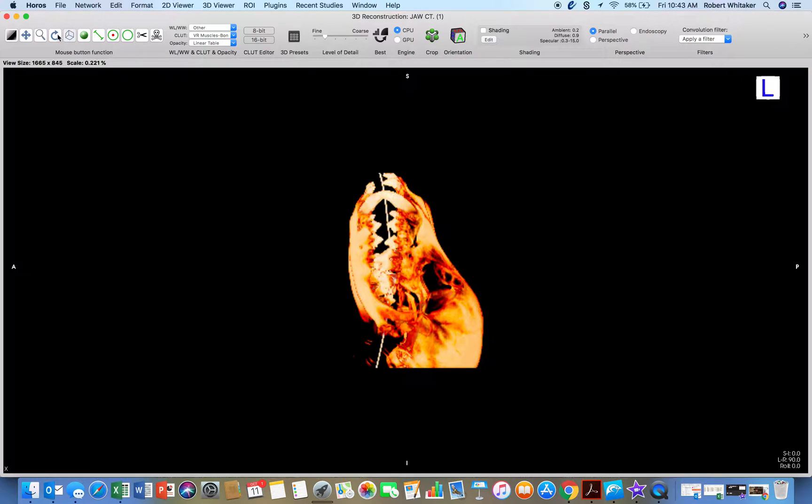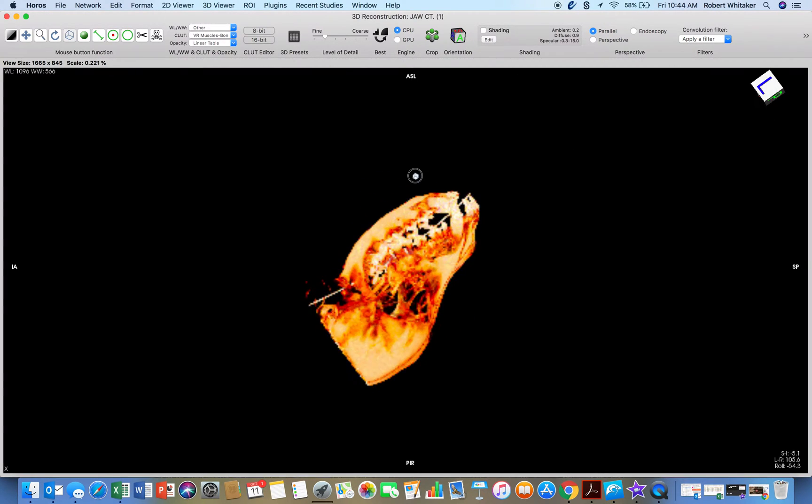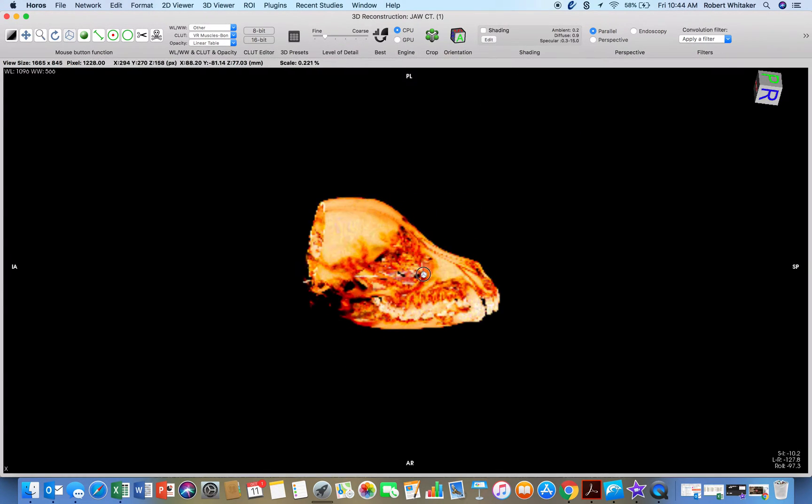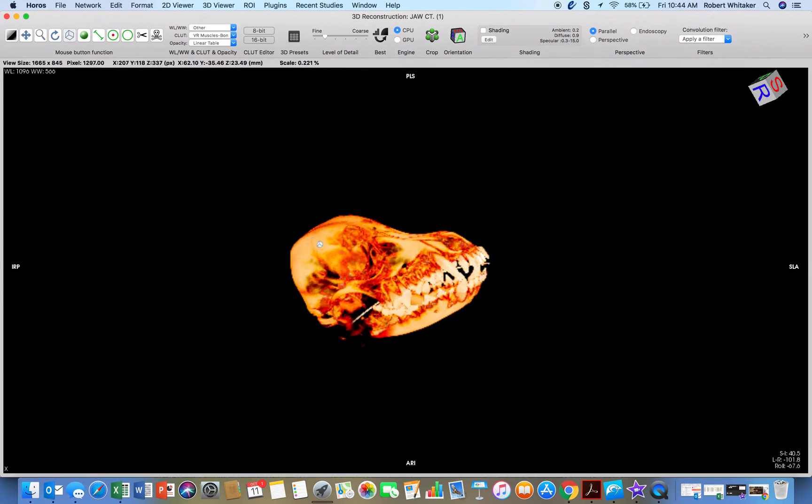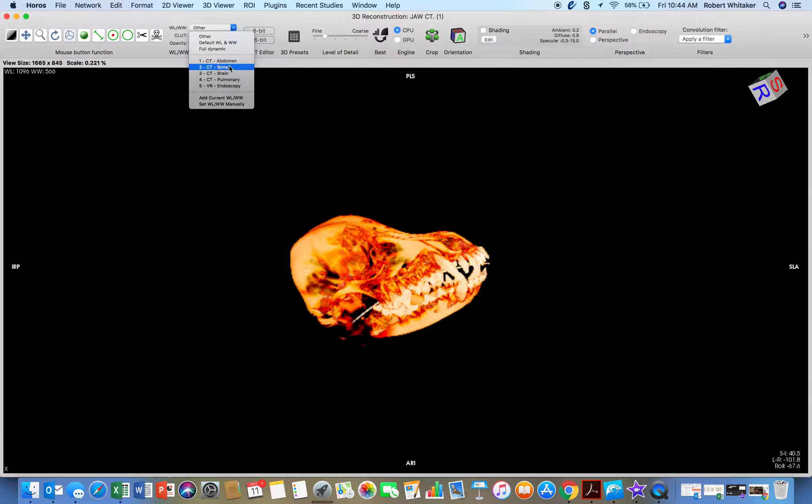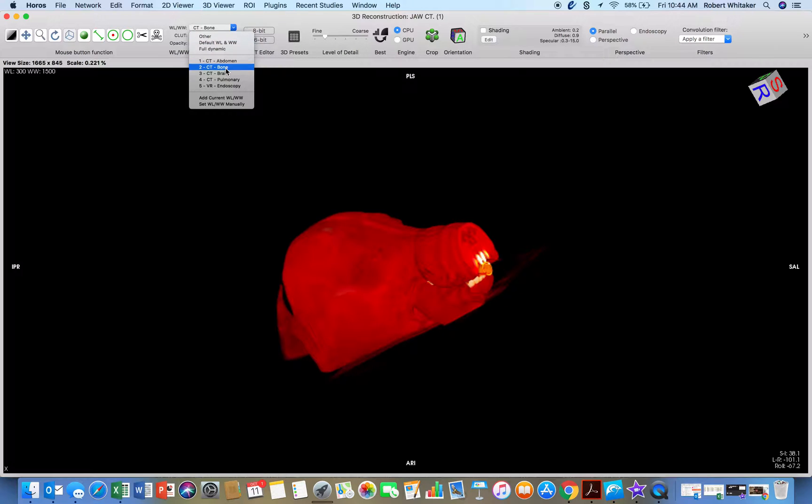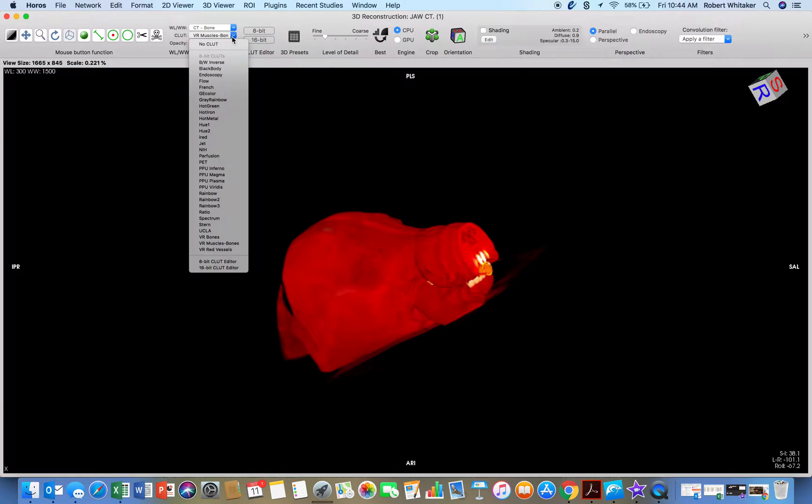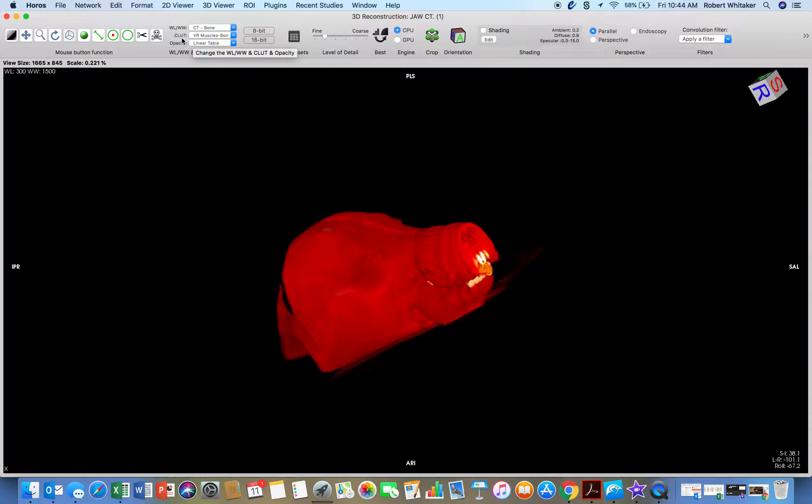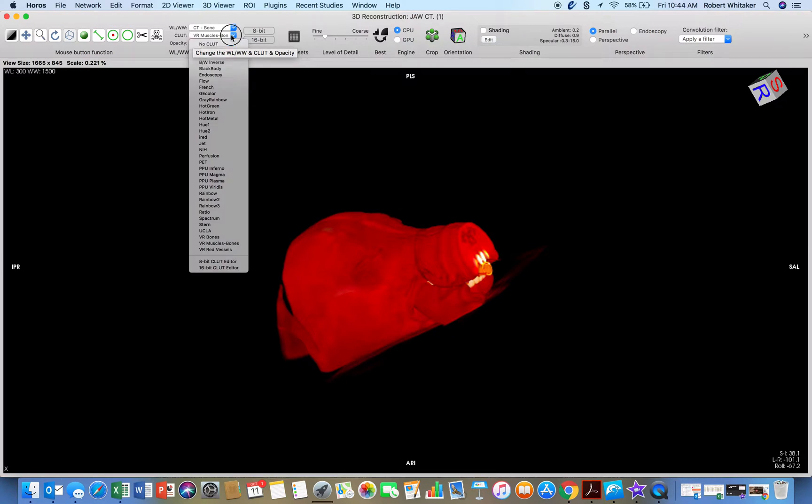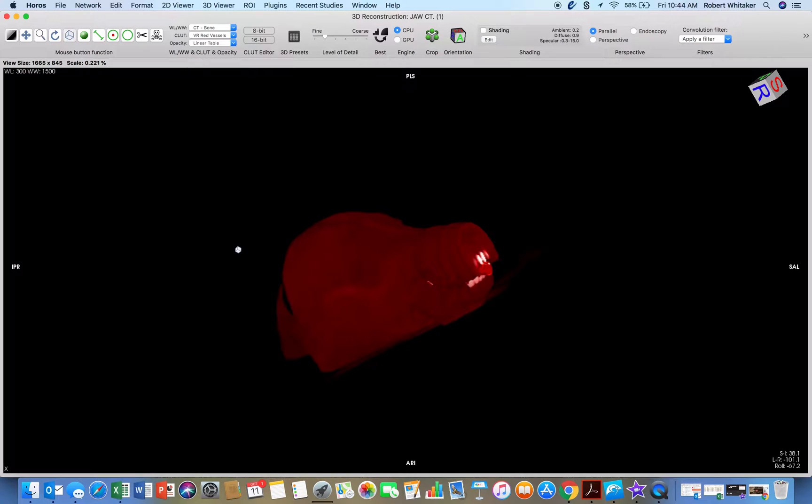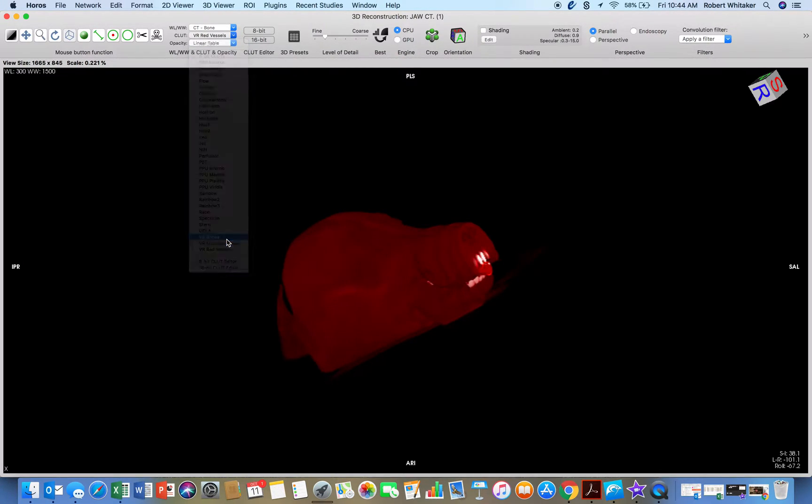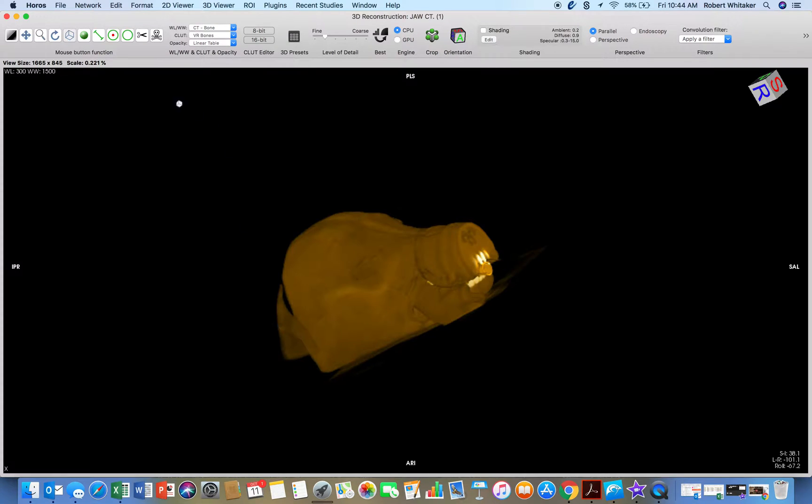These are my tools. If I want to change it, I can change it with these CLUTs. That's a color lookup table. So it changes how it is viewed in the colors. So I can just do bones for dentistry.